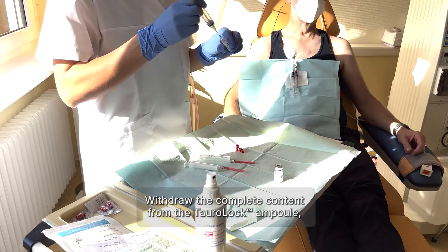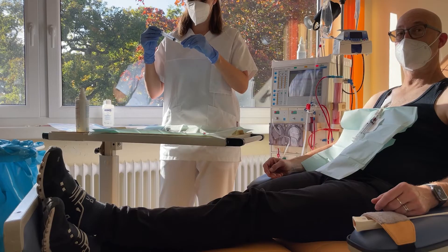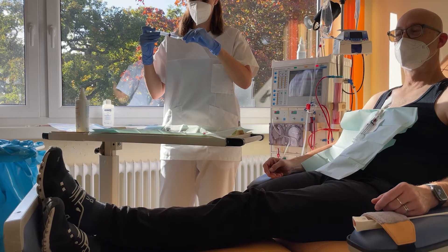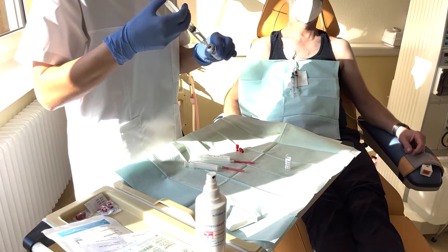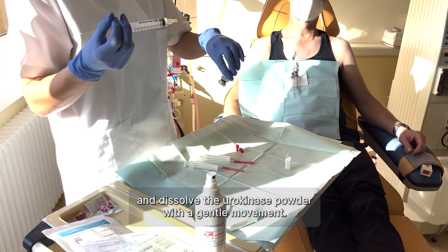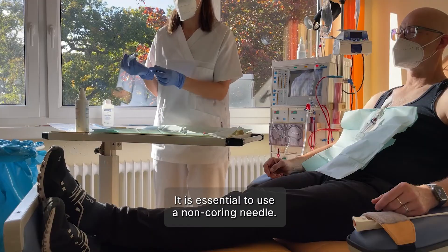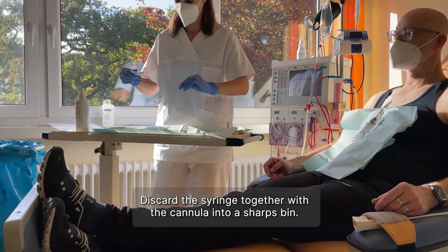Withdraw the complete content from the ToroLoc ampule, fill it into the vial, and dissolve the urokinase powder with a gentle movement. It is essential to use a non-coring needle. Discard the syringe together with the cannula into a sharps bin.